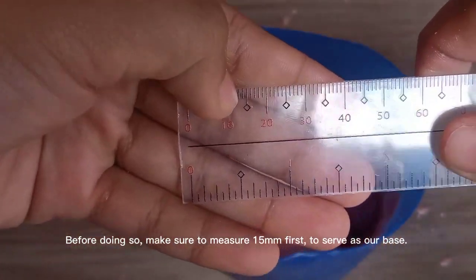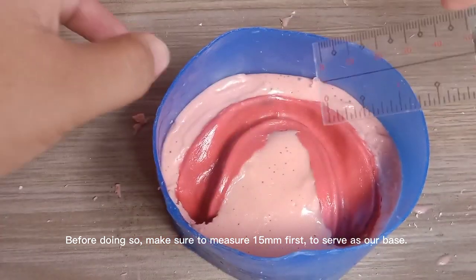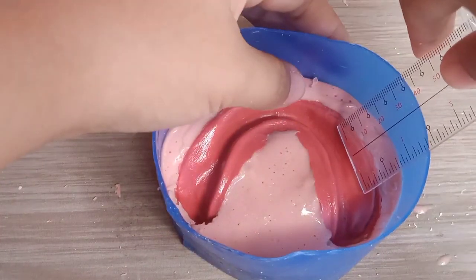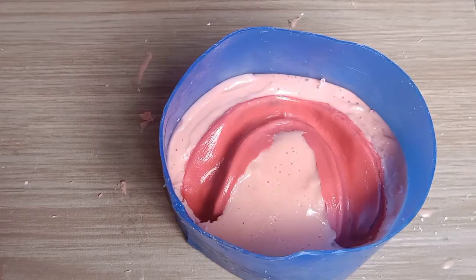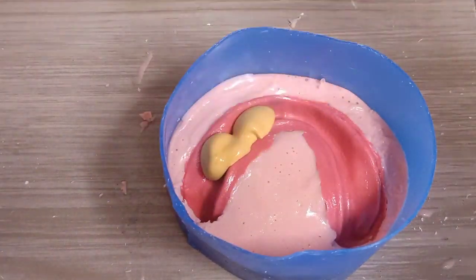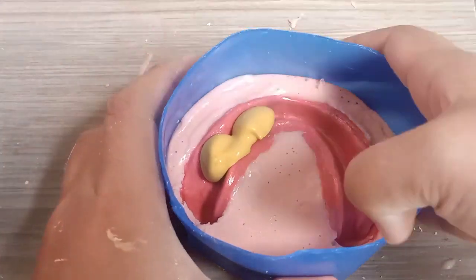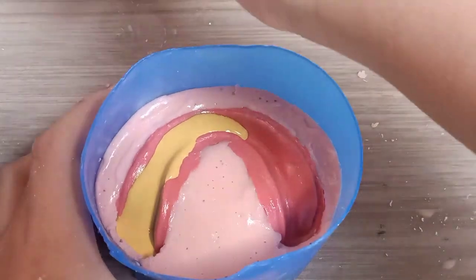Before doing so, make sure to measure 15 millimeters first to serve as our base. Once done, pour your cast stone. Tap, tap to prevent bubbles.